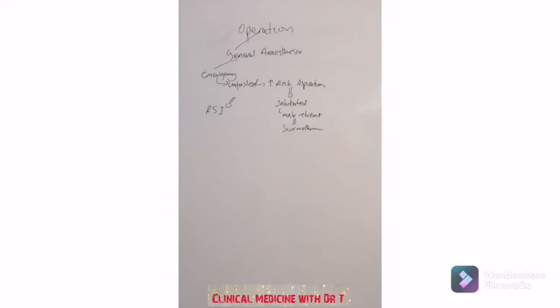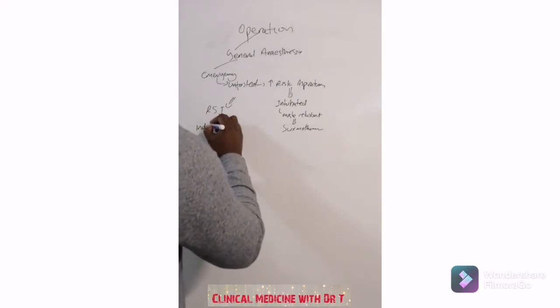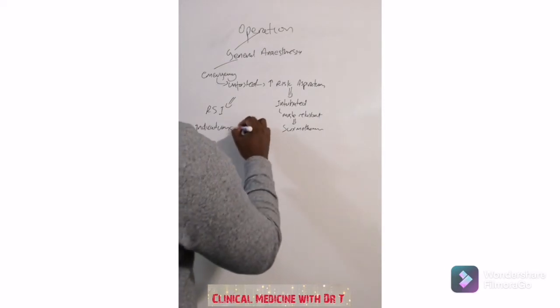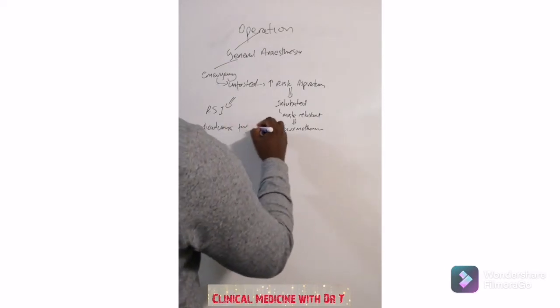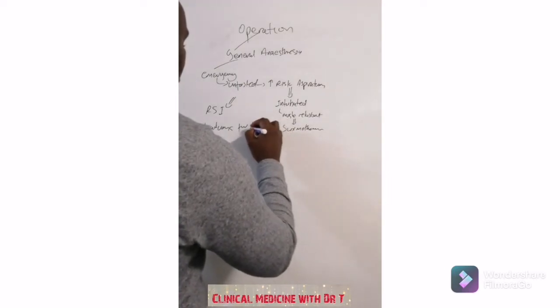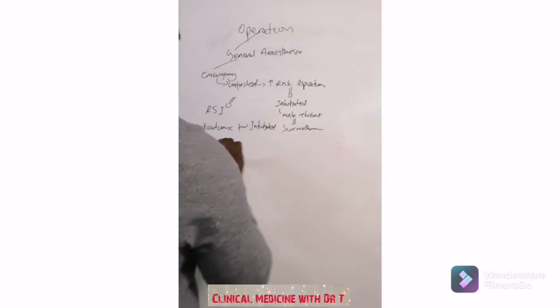Maybe you ask yourself, what other patients require an intubation? So that will take us to the indications for intubation. Which patients must be intubated?